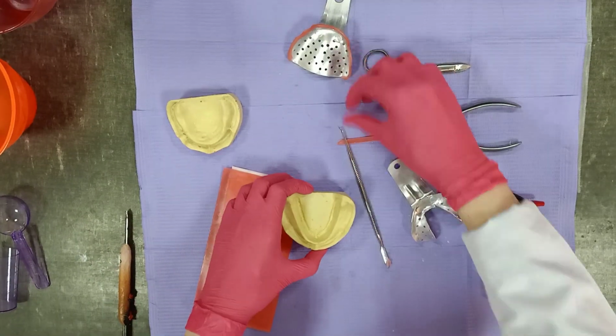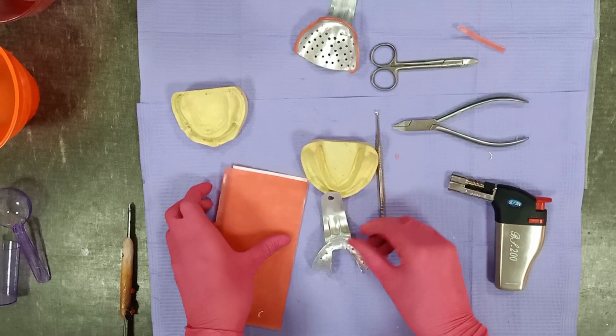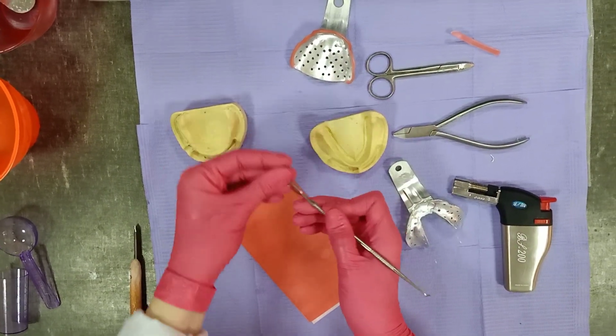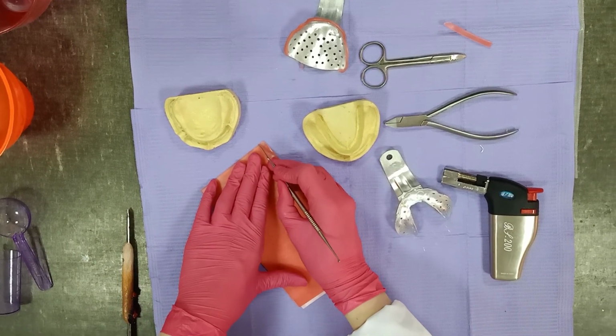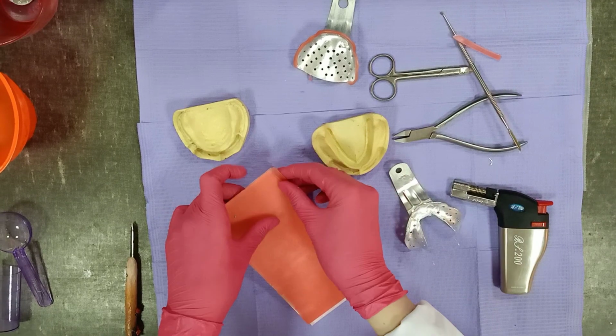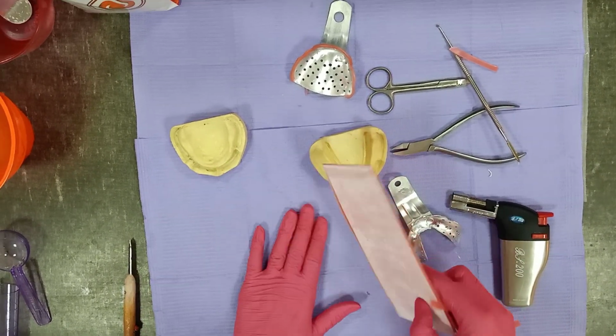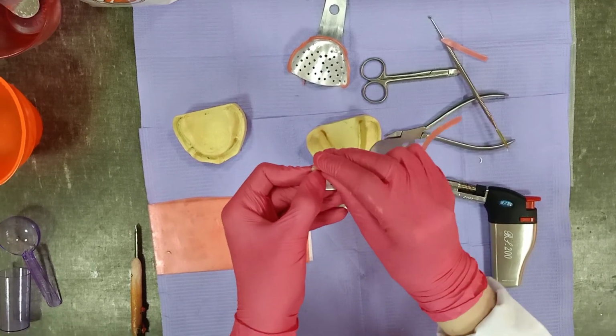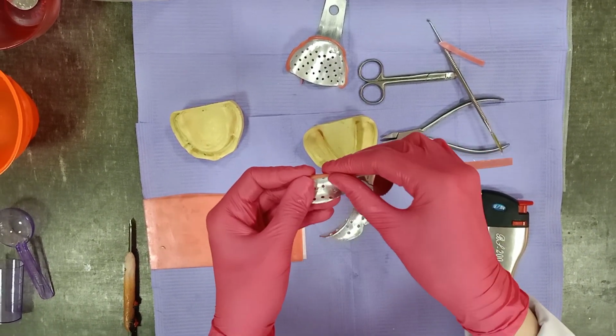In the lower, we are going to do the same, also using a strip of wax to cover all the borders of the tray to avoid any sharp areas before taking the impression.